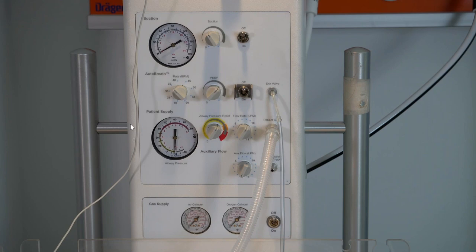Another question: the resuscitator can be used on intubated babies only. Please comment on this.